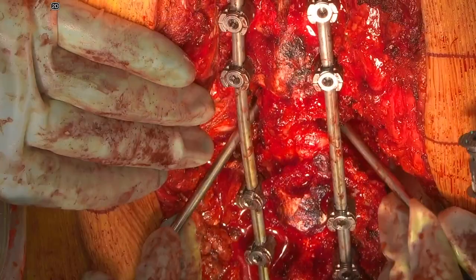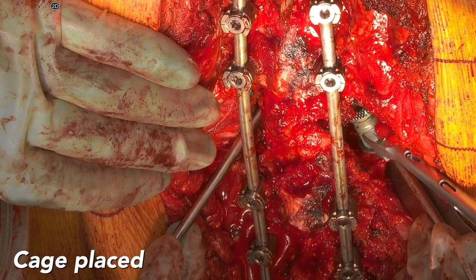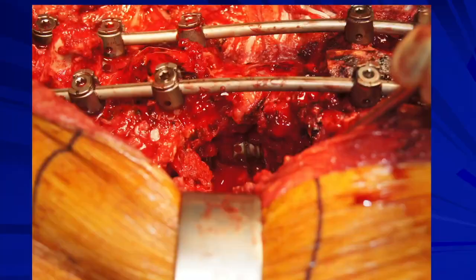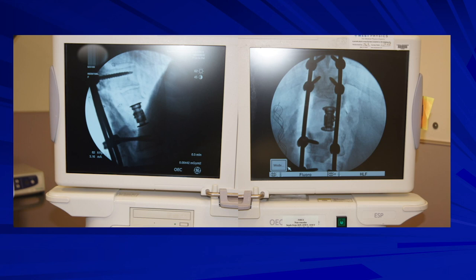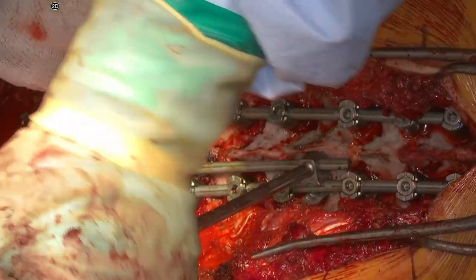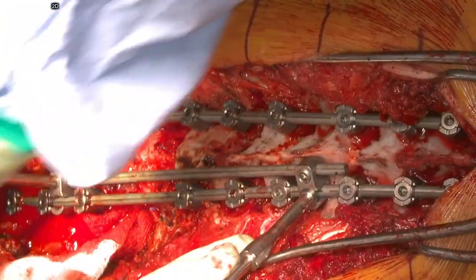Now the anterior vertebral bodies are more parallel and a cage is sized and placed from endplate to endplate anteriorly. This photograph shows the placement of the cage and the correction of the kyphosis — the shortening posteriorly and the lengthening anteriorly of the spinal column. This is a photograph from the image intensifier showing the cage placement. An additional rod is placed across the three-column osteotomy to make it more mechanically sound and prevent early rod failure.